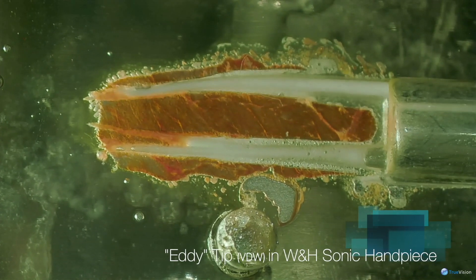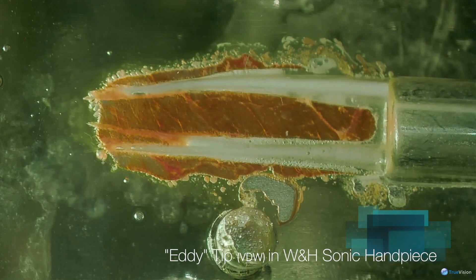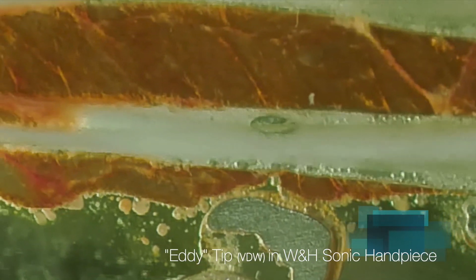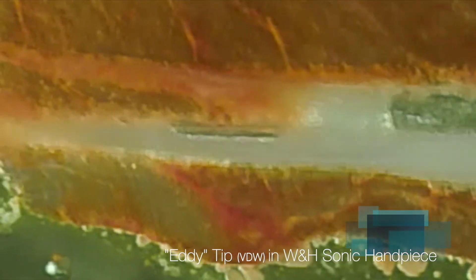Again, sonication with an eddy tip. I just love watching this close-up. Got a really nice, sharp focus here.